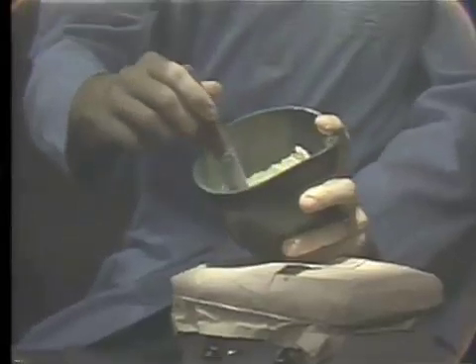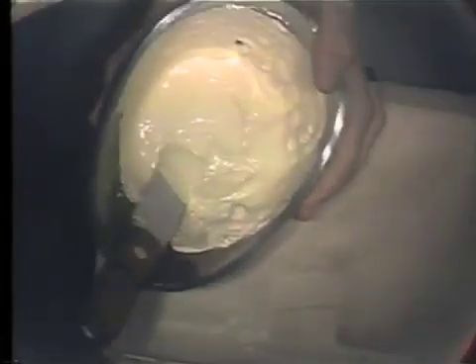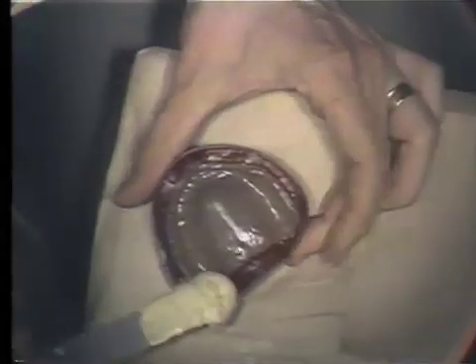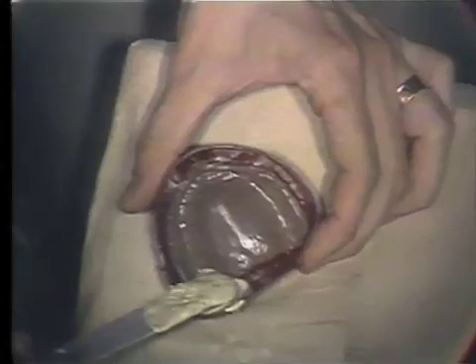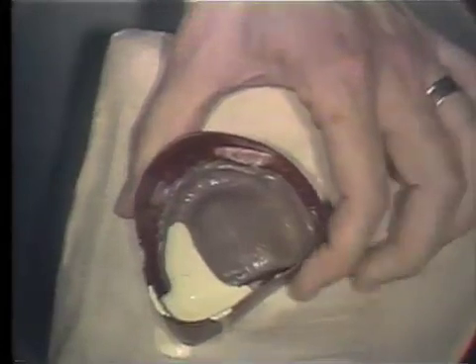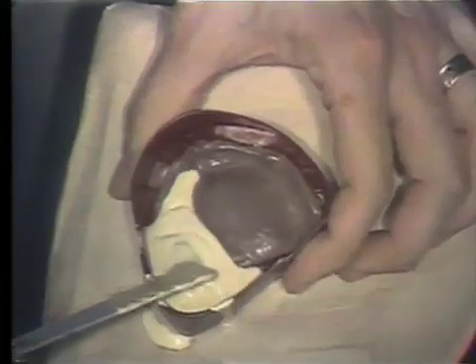Trying to eliminate the air here. We will then take the impression that is boxed up, place it on the vibrator, and make small applications of the stone starting at one corner, permitting the air to escape just ahead of the poured stone.